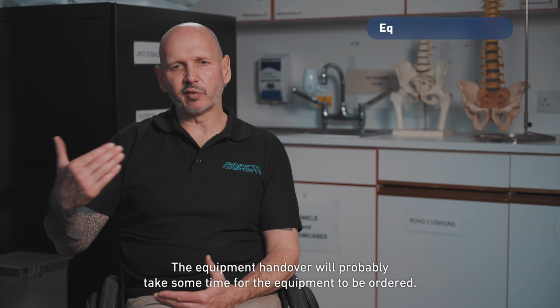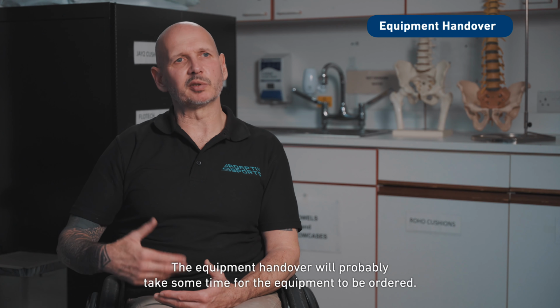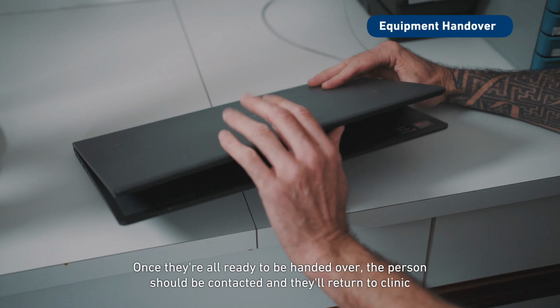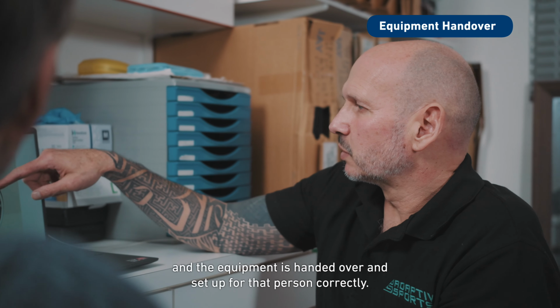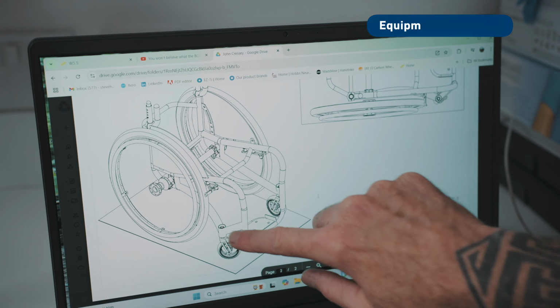The equipment handover will probably take some time for the equipment to be ordered. Once they're all ready to be handed over, the person should be contacted and they'll return to clinic and the equipment is handed over and set up for that person correctly.